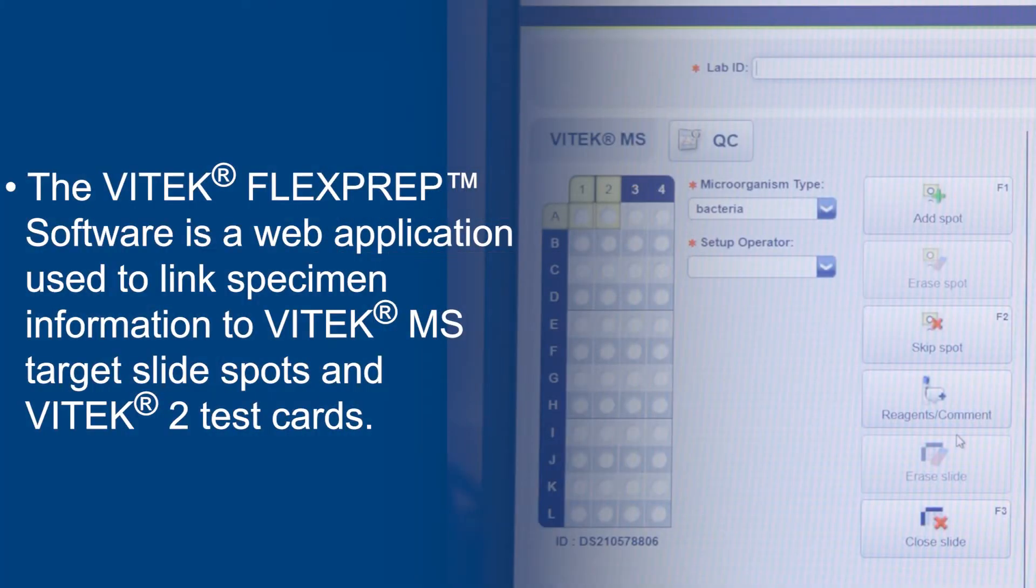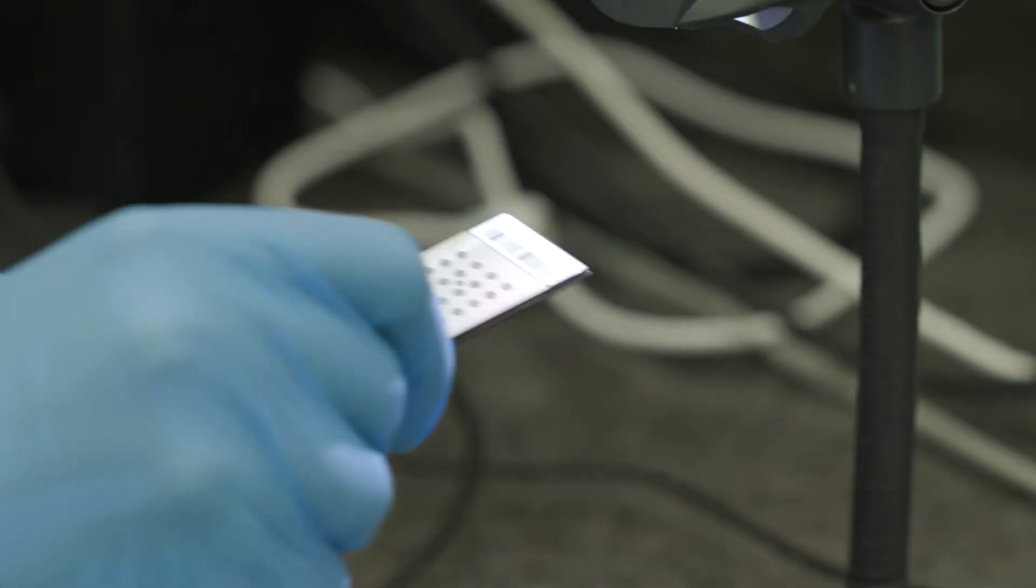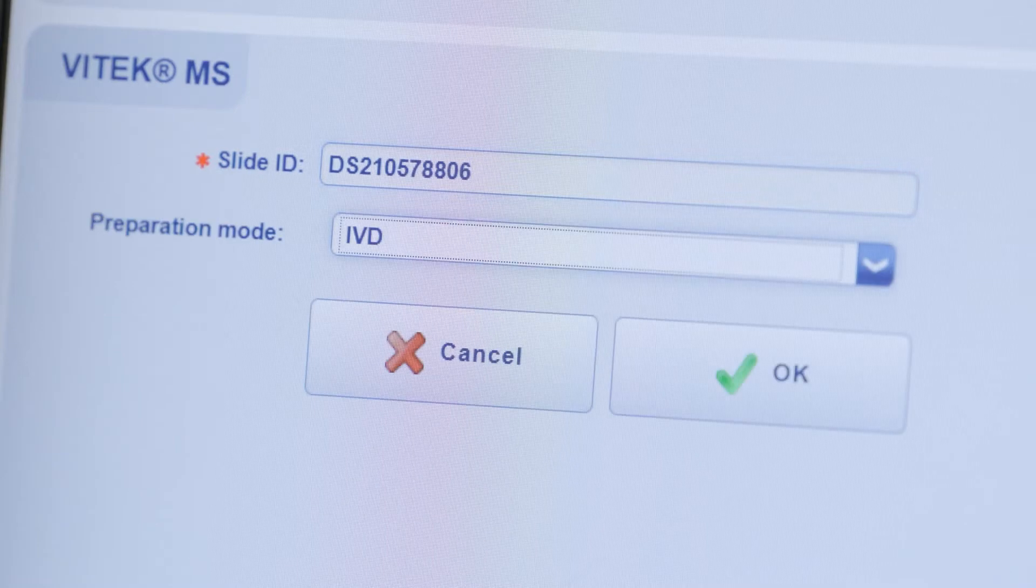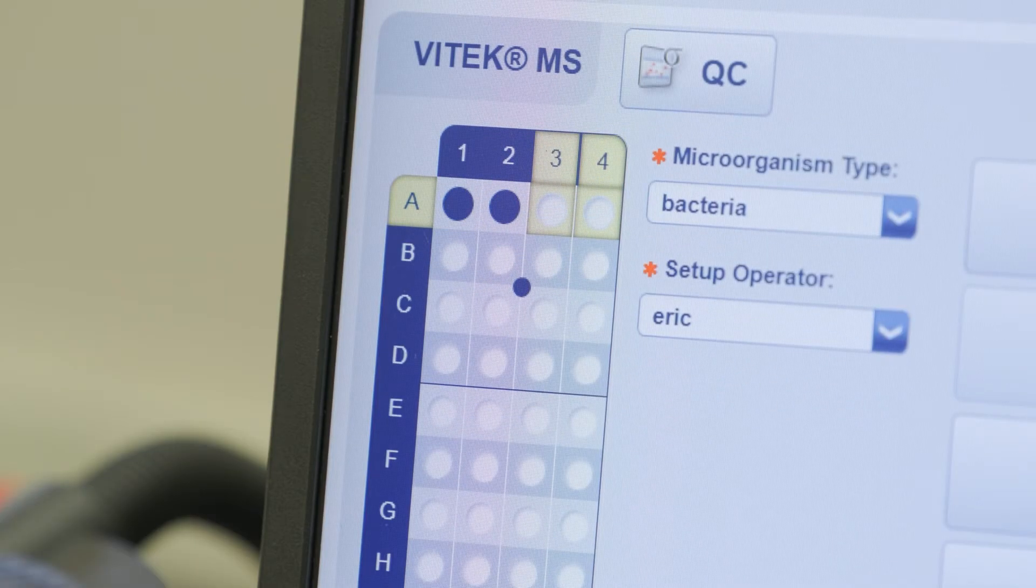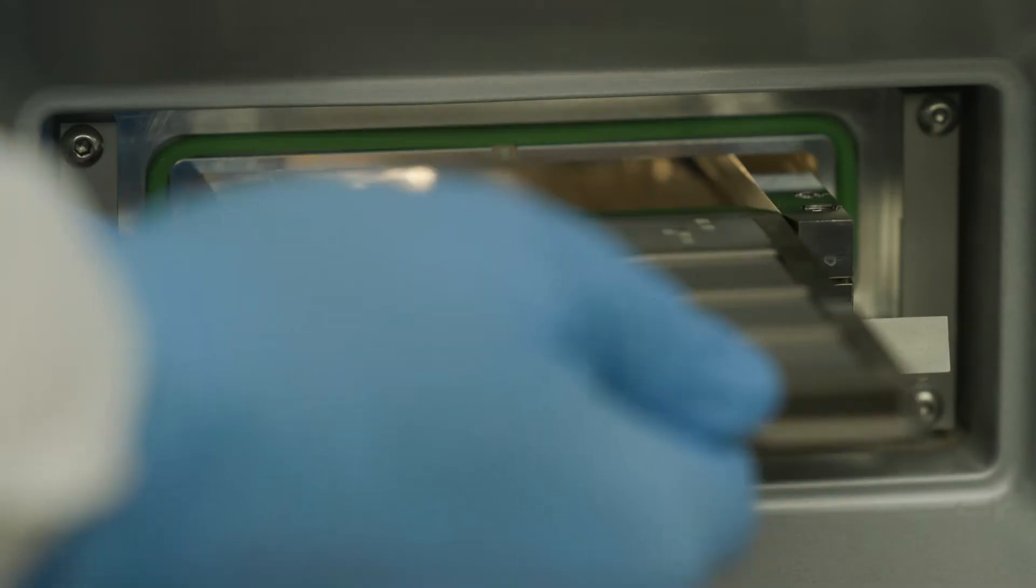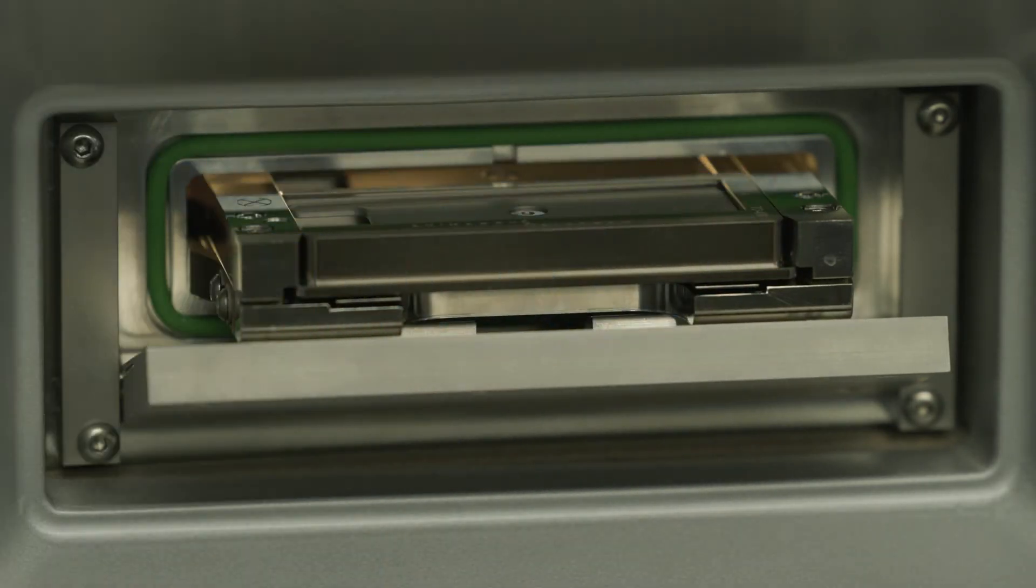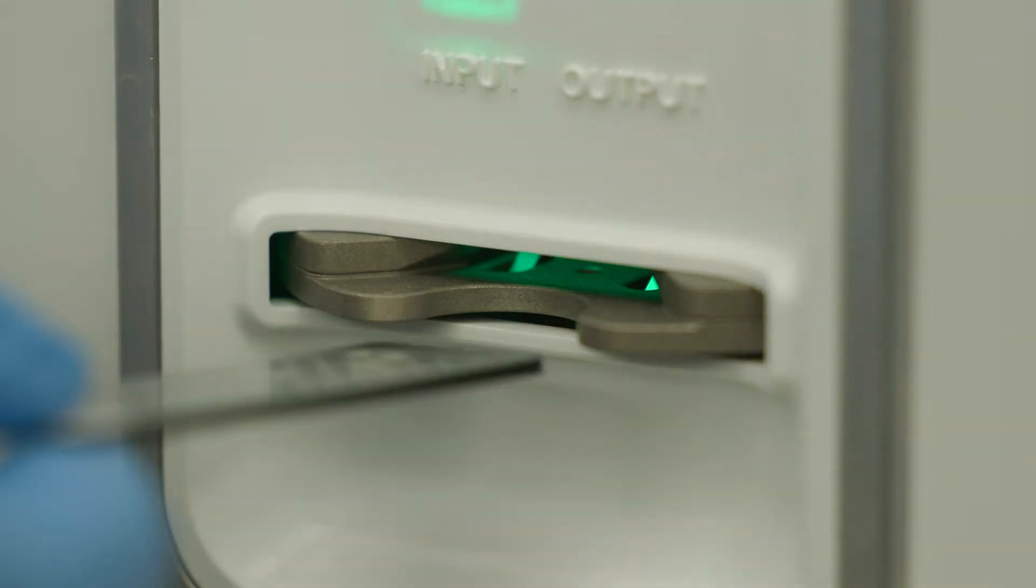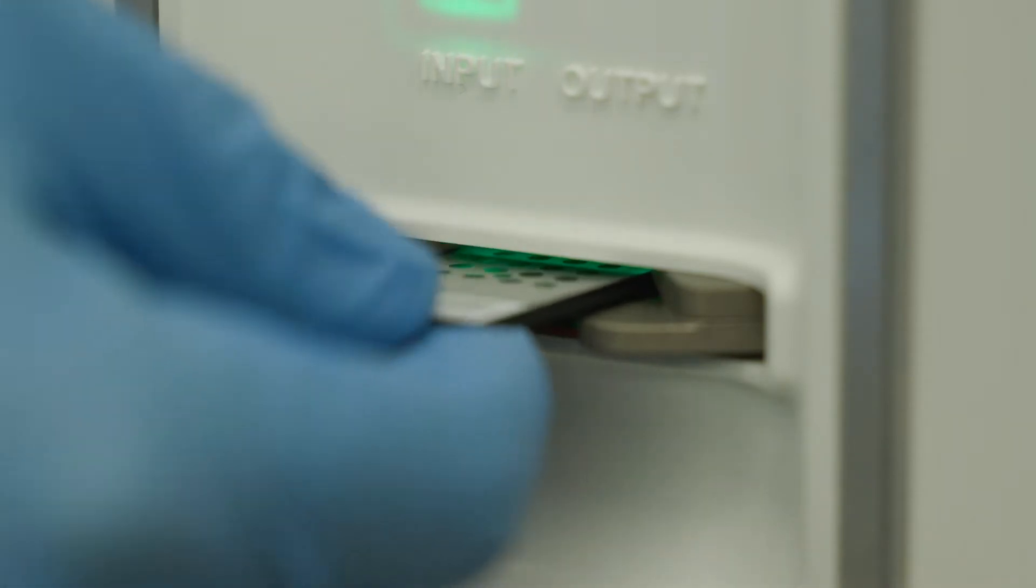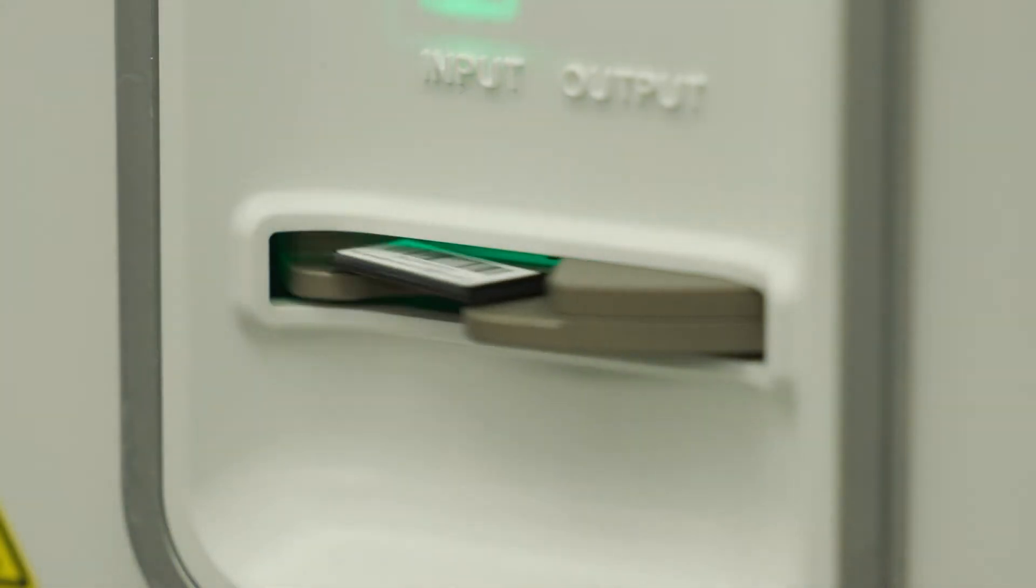The Vitec FlexPrep software is a web application used to link specimen information to Vitec MS target slide spots and Vitec 2 test cards. The linked accession ID, cassette information, and Vitec MS target slide spots can then be transferred to the Vitec MS or Vitec MS Prime and Vitec 2 systems.